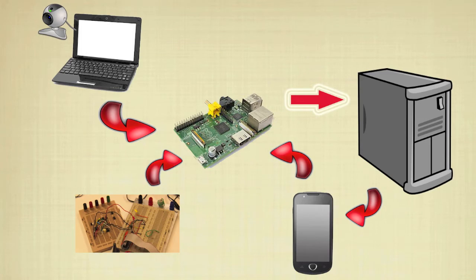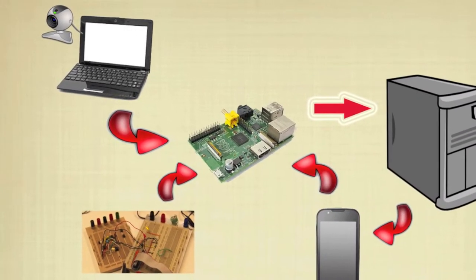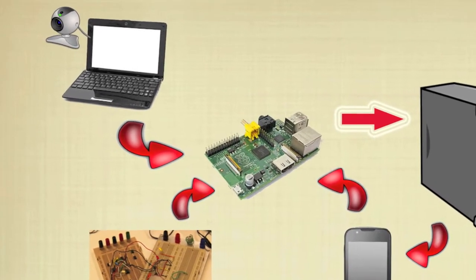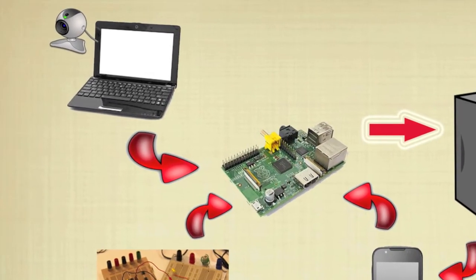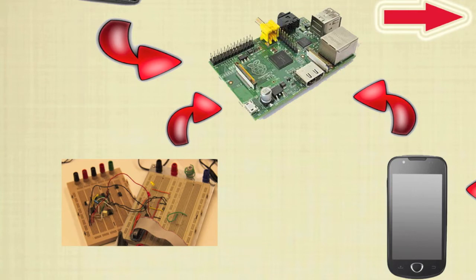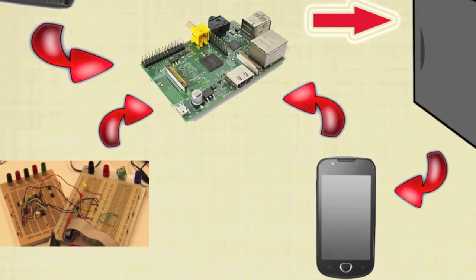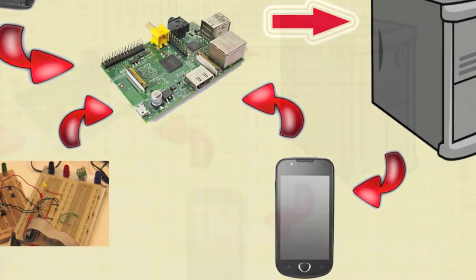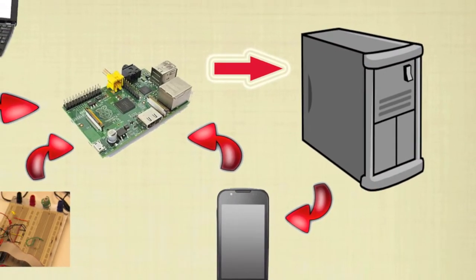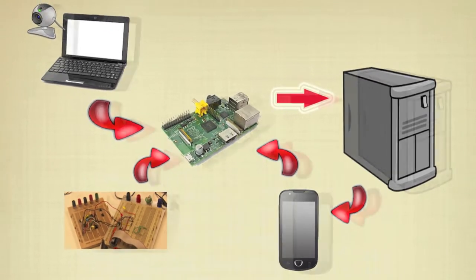This is the scenario that we have developed in the project. In the demo, we will first acquire the heart rate and respiratory rate from the audiovisual system, and we will see how it is sent to the Raspberry. Then, we will do the same with the electronic part. After that, we will configure the Raspberry with the Android terminal in order to send data. Finally, we will show how the data is sent to the server and how it is visualized in the Android terminal.